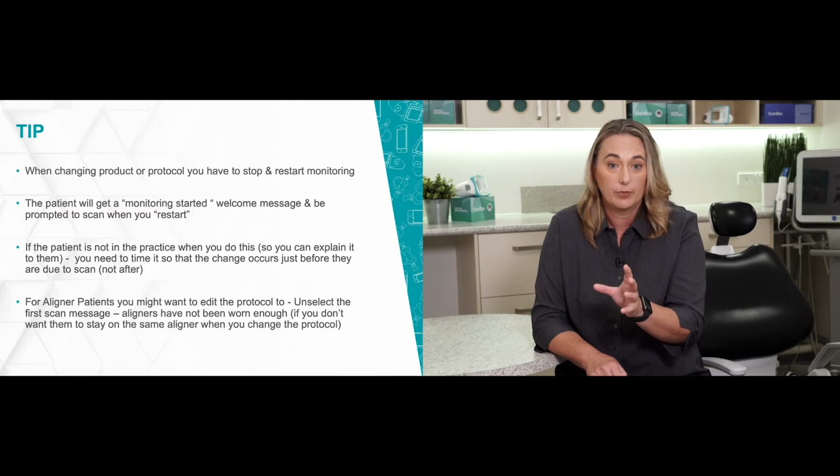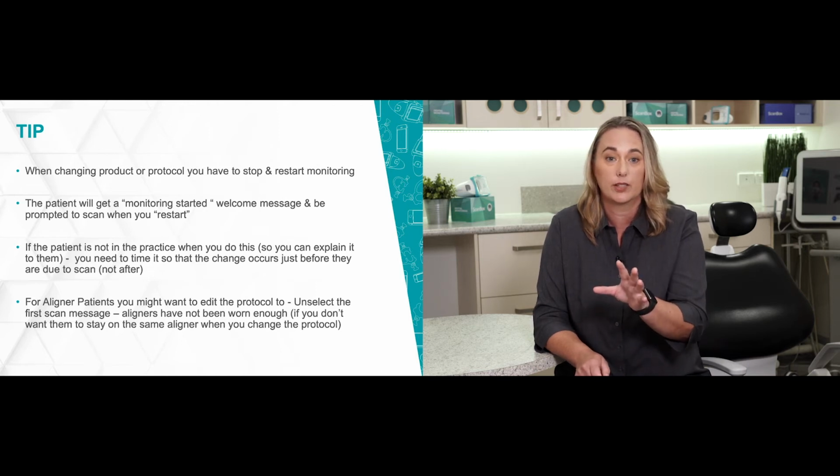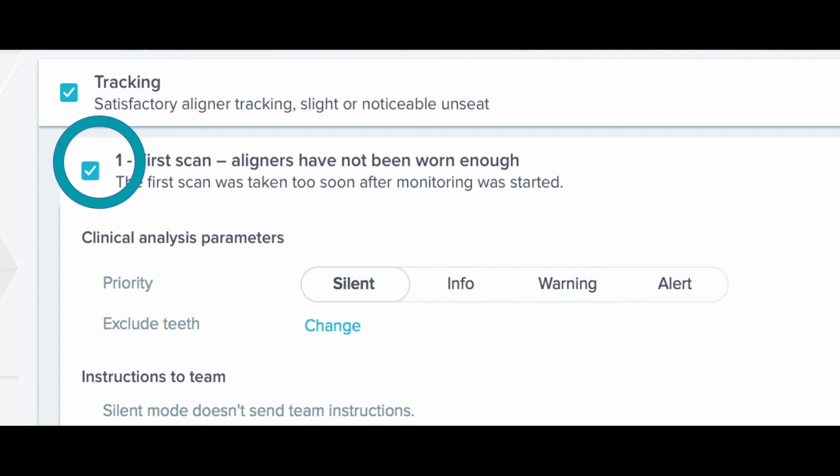For aligner patients particularly, you might want to edit the protocol and unselect the first scan message that says that aligners haven't been worn enough, if you don't want them to stay on the same aligner when you change the protocol. But that will depend on your circumstances. That would be, for example, a modification specific to the patient for that protocol, and just uncheck that box, which is about the first scan.